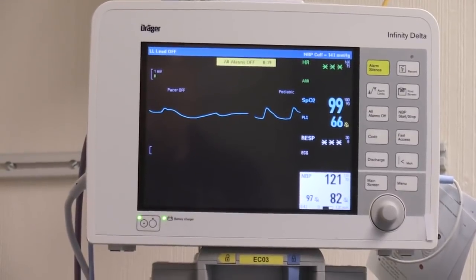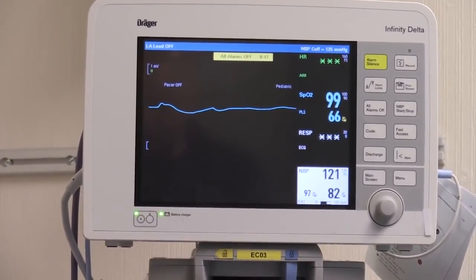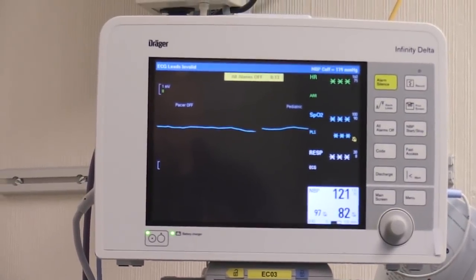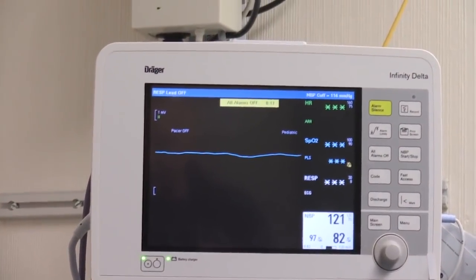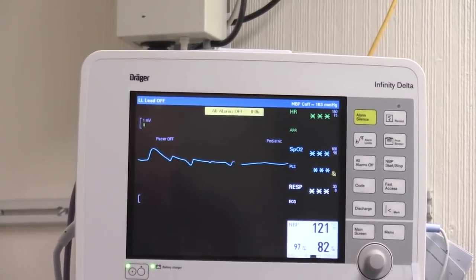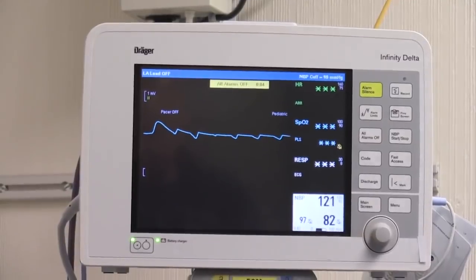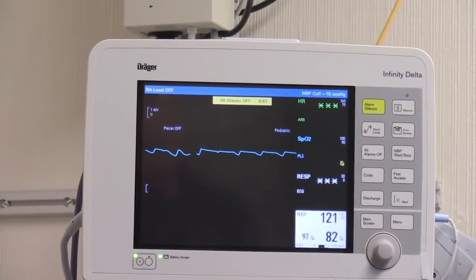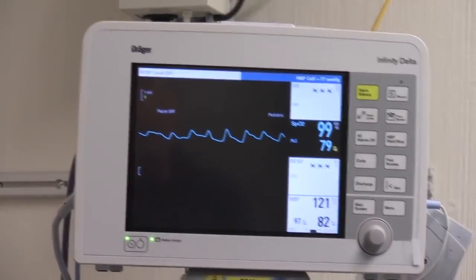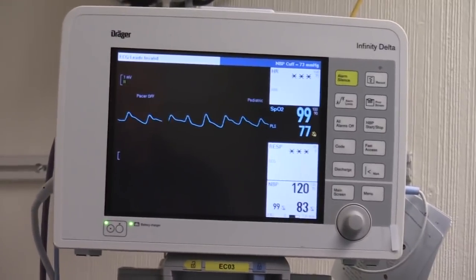Okay, now the waveform's gone. There's probably going to be a lag time in the read, but this cuff stays up only for a few seconds. Okay, so the cuff's going back down. Okay. Oh, so we actually lost our read. We lost the read too. Okay, good. That's really just what I wanted to demonstrate.